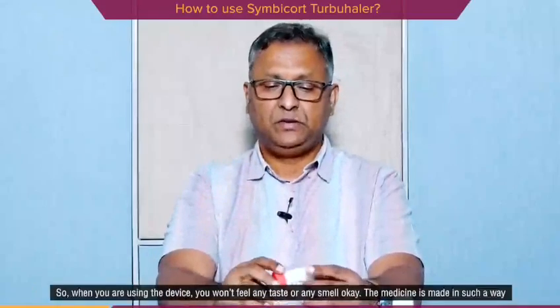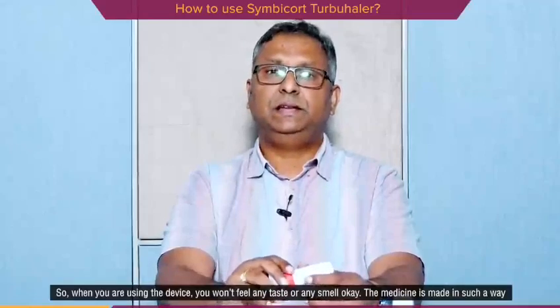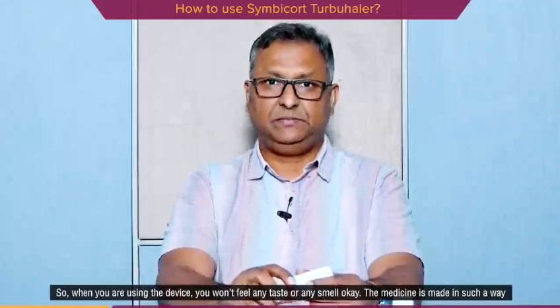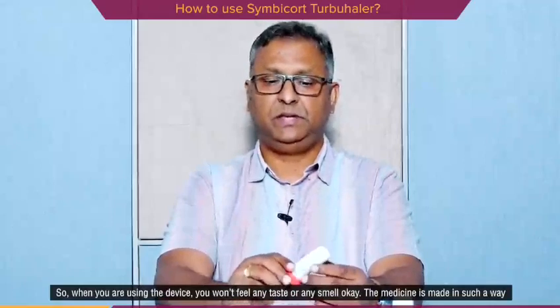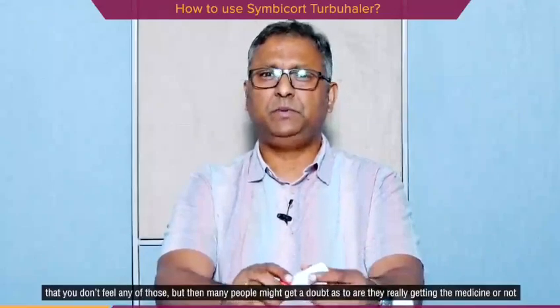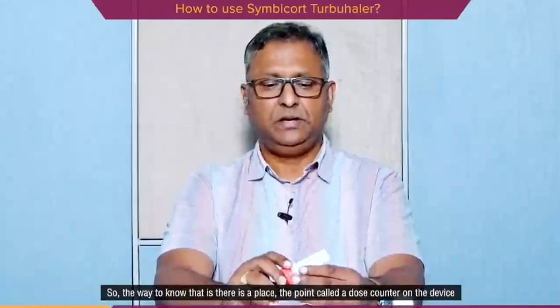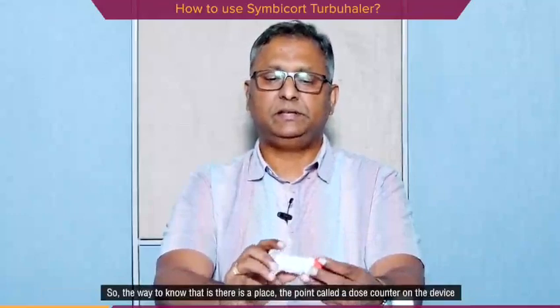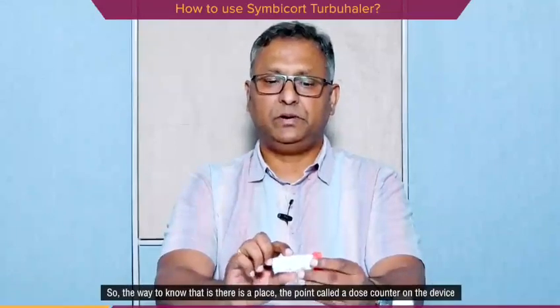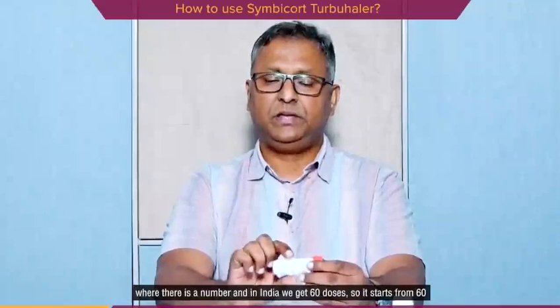Okay? So when you're using the device, you won't feel any taste or any smell. The medicine is made in such a way that you don't feel any of those. But then many people might get a doubt as to whether they are really getting the medicine or not. So the way to know that is there is a point called a dose counter on the device where there is a number, and in India we get 60 doses, so it starts from 60.